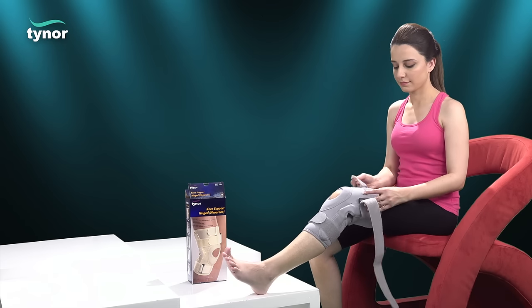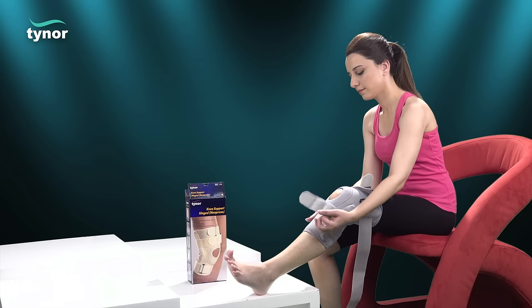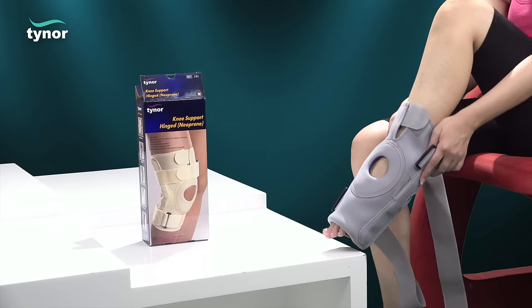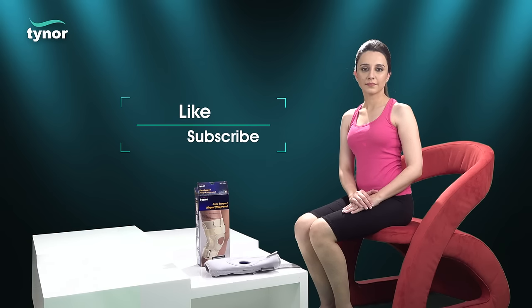To remove the knee support hinged neoprene, unfasten the hook-loop fasteners and easily remove the product using a pull-down action.